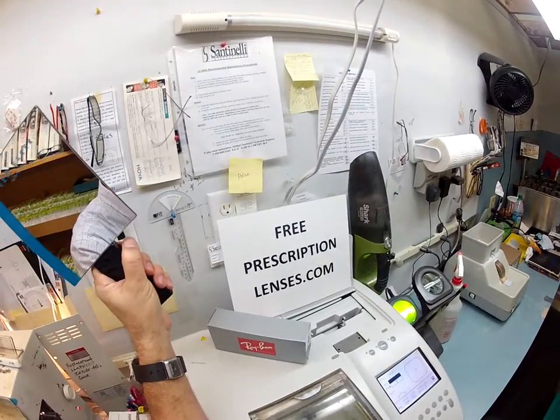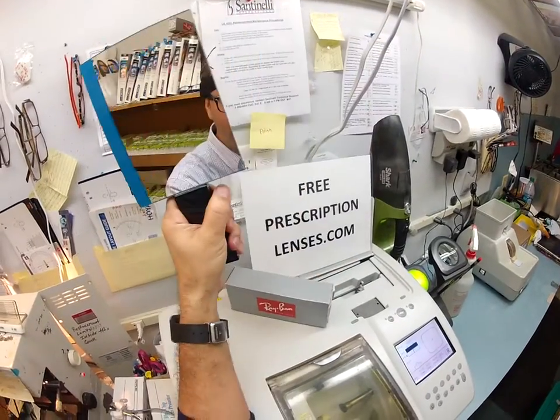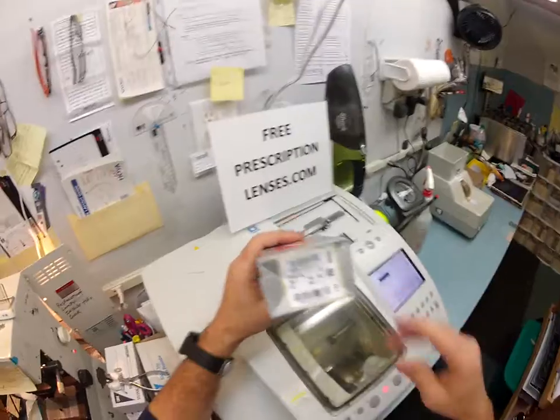Okay Tyler, Matthew here with FreePrescriptionLenses.com and I'm about to show you how I make transition lenses for your Ray-Ban 2132, which I get to send to Pompano Beach, Florida. I've had two ice storms within seven days — you know how lucky you are to live in Pompano Beach, Florida.